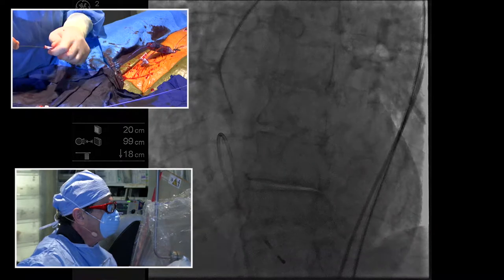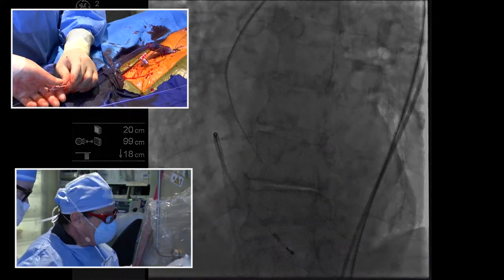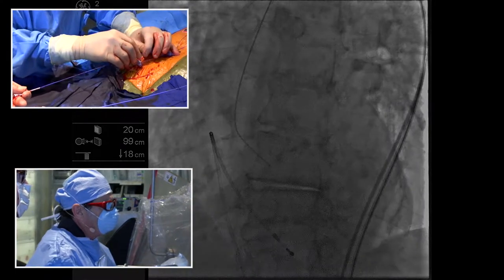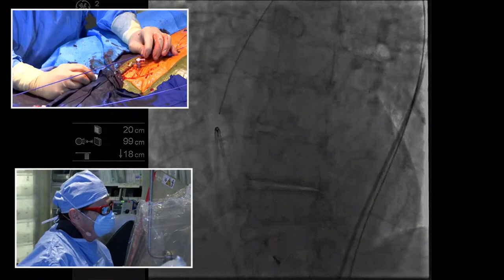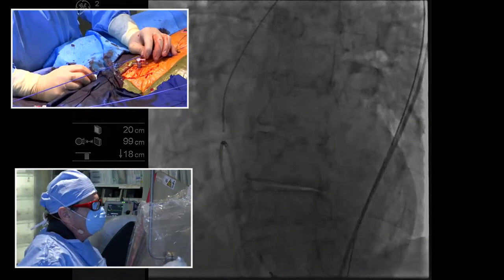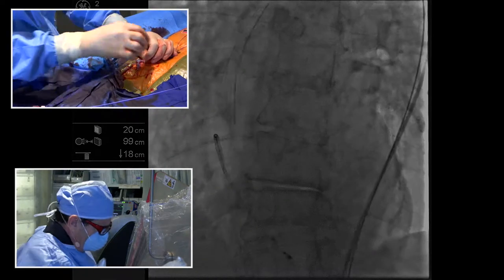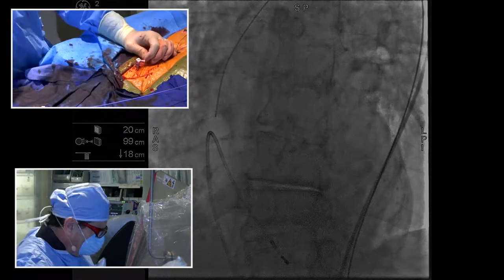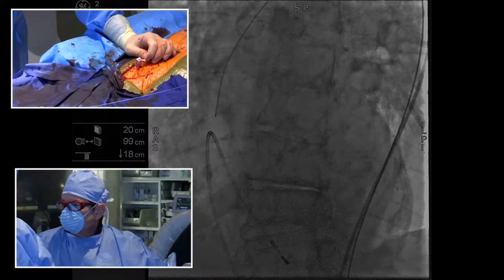You got the AL2? Yep. This is not good at all. Okay. I'll walk it out. Walk it out. Just be careful with that stiff wire. Right? Yeah, that's good. You don't want to go into the coronary. That's the key. Okay, good. I've got it out. We'll put the JL. This is going to be a bigger catheter. Three-way stopcock. This high pressure.